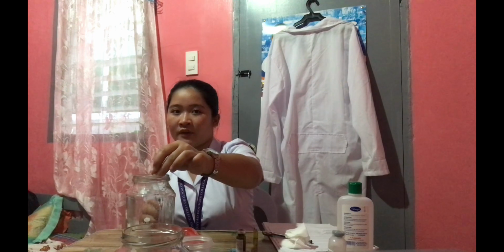I'm going to recap the needle so I can take the aspirating needle off. Then discard the aspirating needle into the sharps container so that we can avoid a needle prick injury, and connect the syringe to the right size needle. Tighten the cap at the hub of the needle and place it in the medication tray, and then I'm going to write the medication ticket.